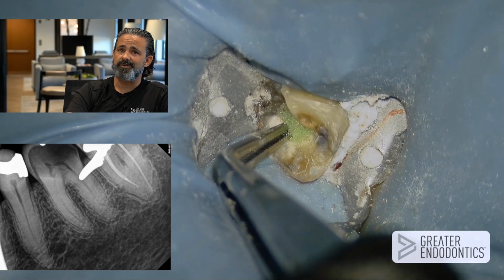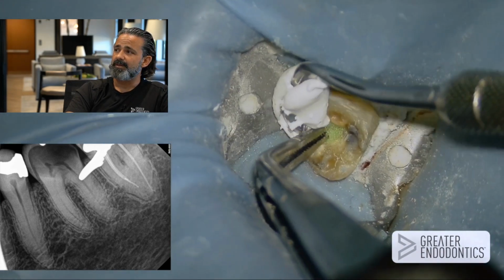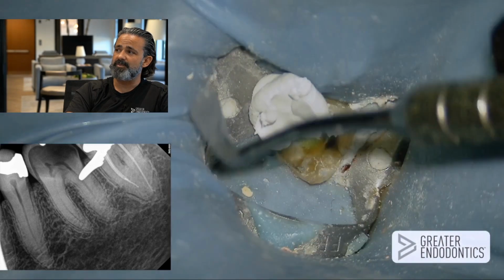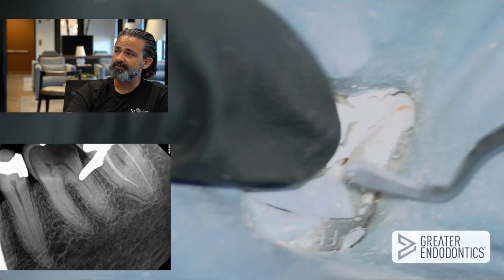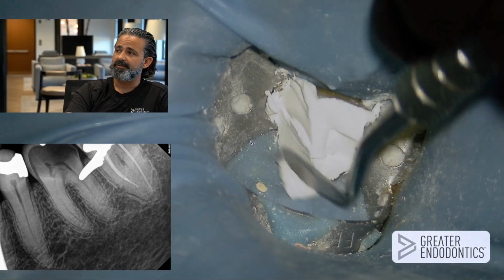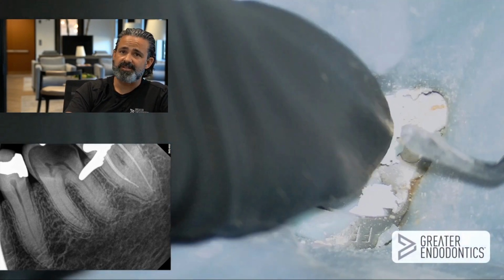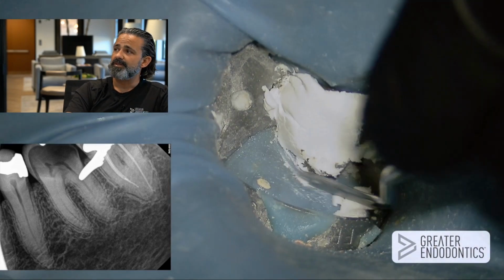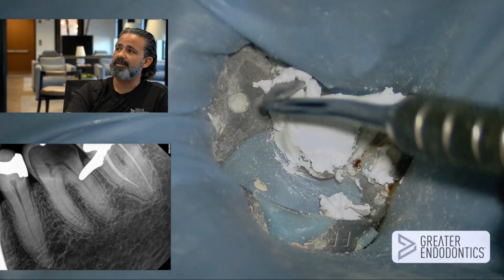It's always a pain when you're missing three-quarters of the tooth, right? And then I'm just using a temporary material. This is Cavit. It's the name of this product. It's white, not pink. Easy to dispense. Assistants like it, so we use it. Patient, fortunately, is heading right over to the dentist for the filling.